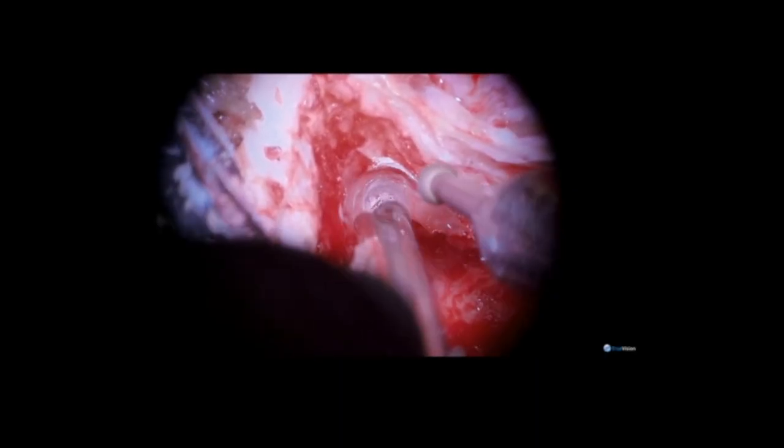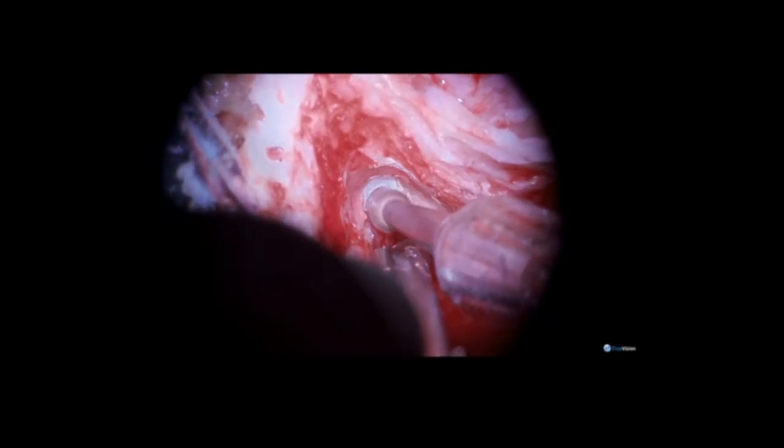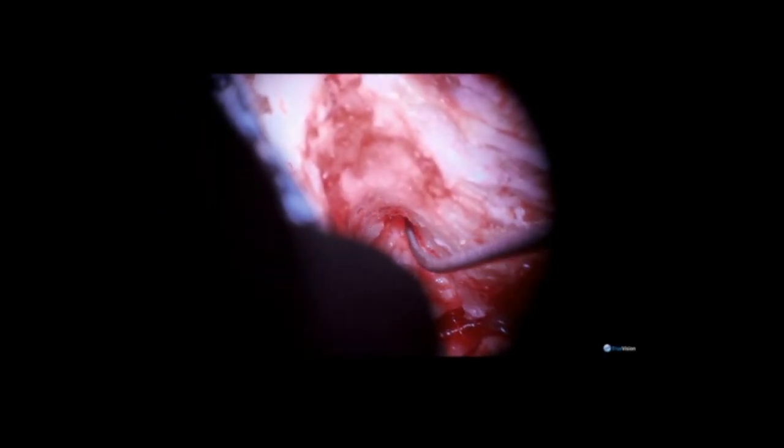At this point, I will complete the dissection of the epitympanic region, keeping the canal wall intact and working from the mastoid side. You can see here how I am carefully dissecting the intact matrix from the adjacent bony structures.